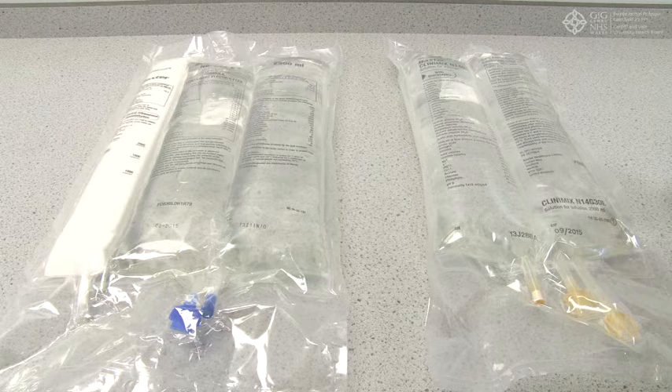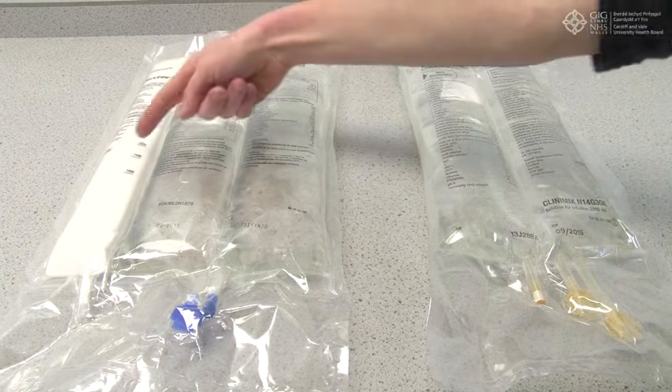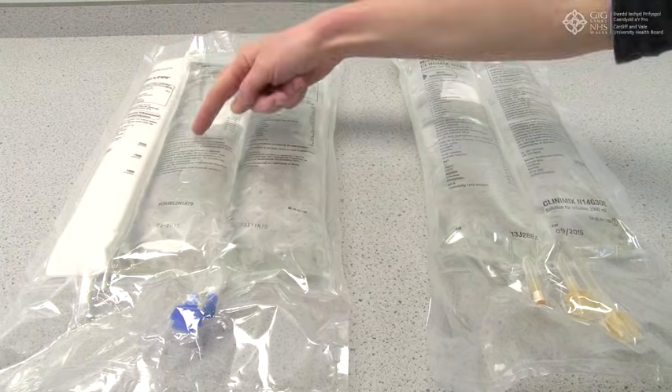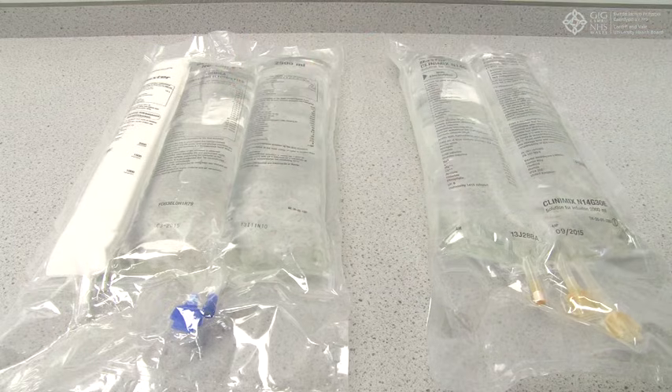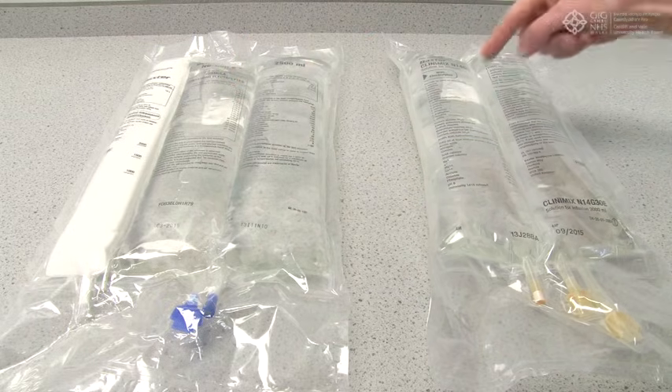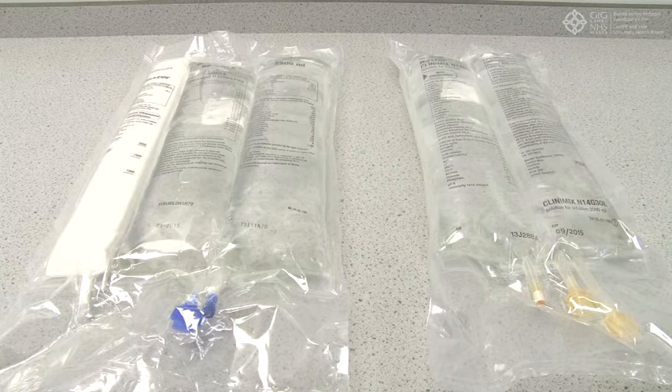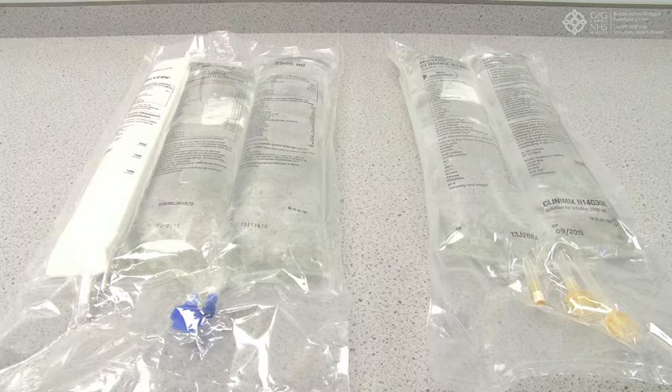Your bag will contain either three or two chambers, each containing lipid, glucose and protein, or just glucose and protein. By keeping these constituents separate, it means the bags have a long shelf life and do not need to be refrigerated. The bags vary slightly in their appearance but the principle remains the same. To demonstrate, I will be using the Baxter range.